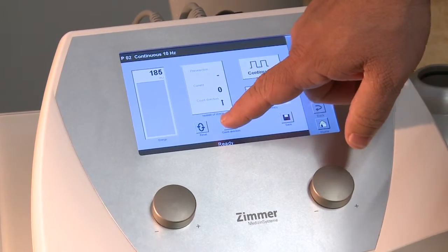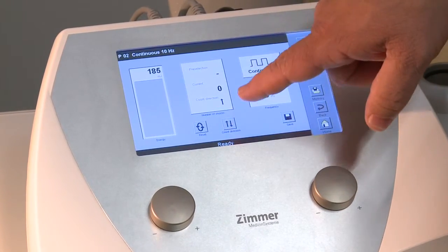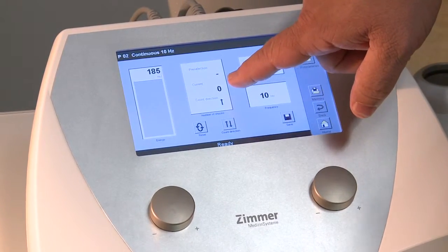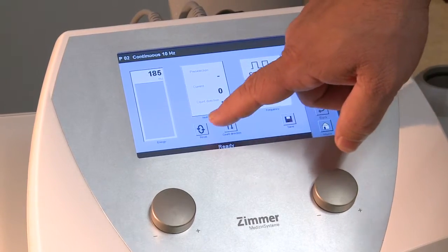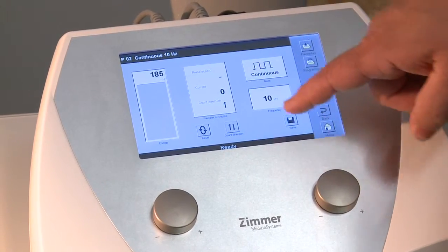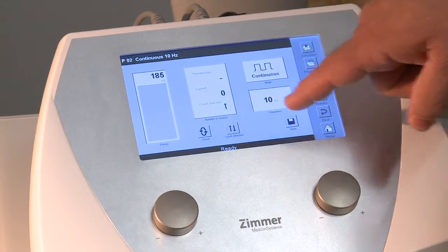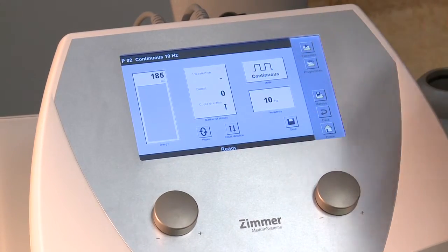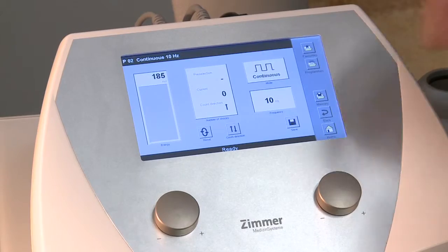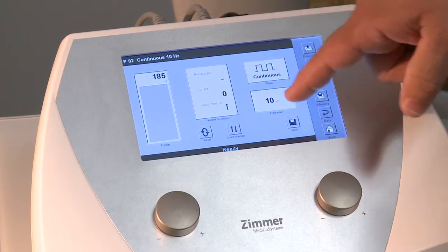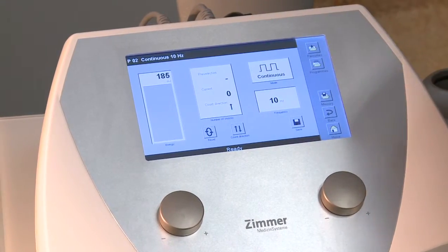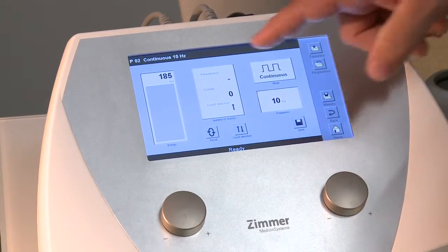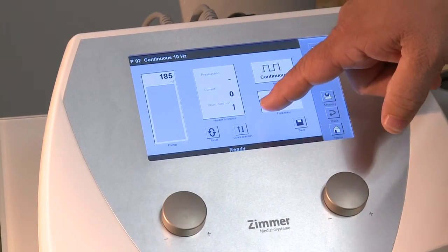The second setting is that instead of the treatment being timed, it is simply a matter of a counter. The average treatment is going to be between 1,500 and 3,000 pulses into the tissue.